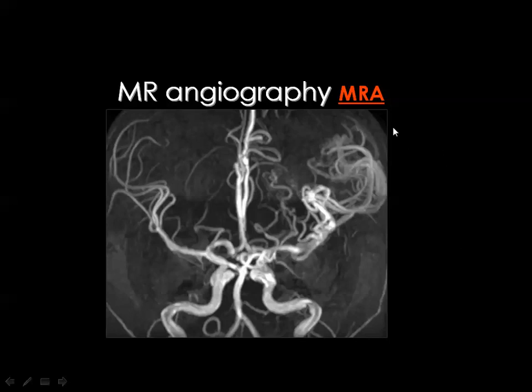In MR angiography, you do not need to inject contrast material, you just depend on the flow, and these are also known as the flow sensitive techniques. So you can see the blood vessels, you can see all the moving particles in the body depending on the way how to image.